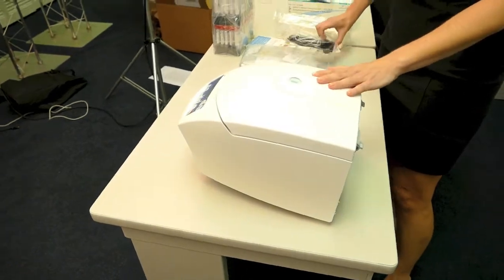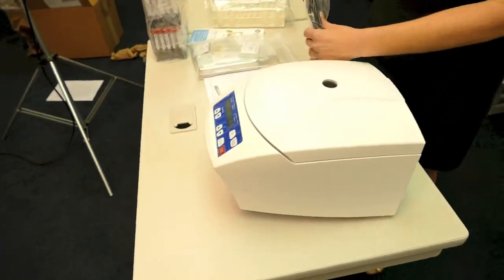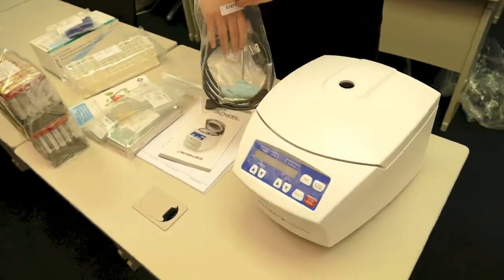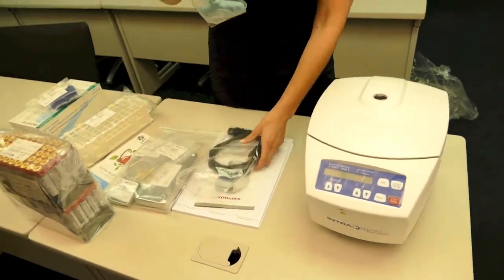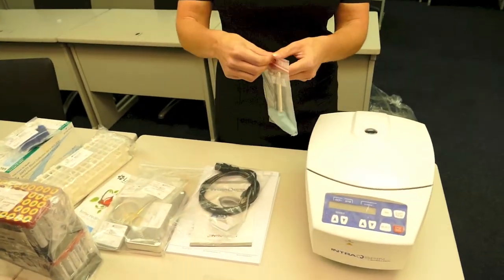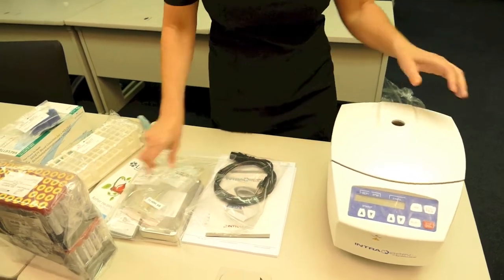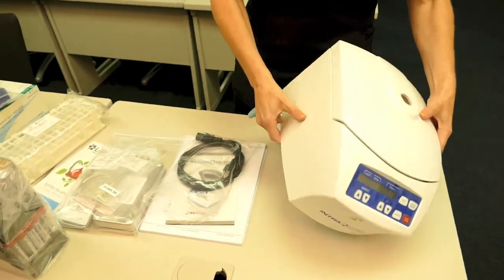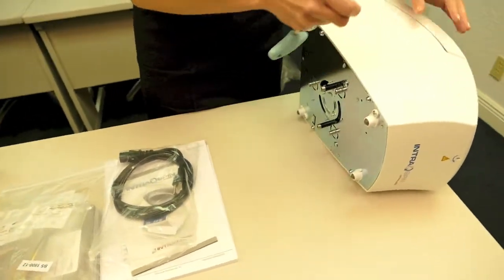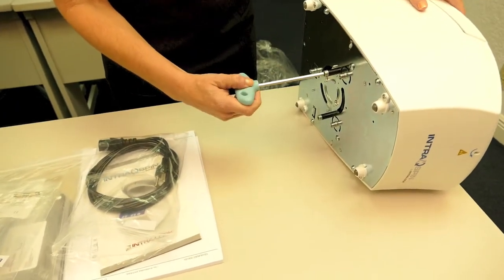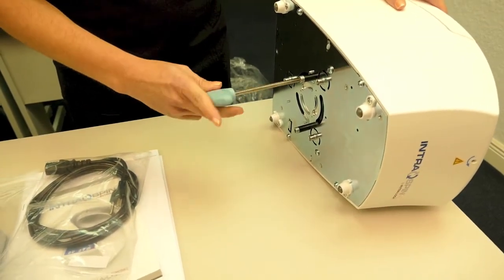What we want to remember is to have it on a flat surface. You're going to notice the hand driver. What this is for is to remove the bolts underneath the centrifuge. These are for travel. If you're ever going to be taking the machine to another office, carrying it with you, you'll want to put these back in place.